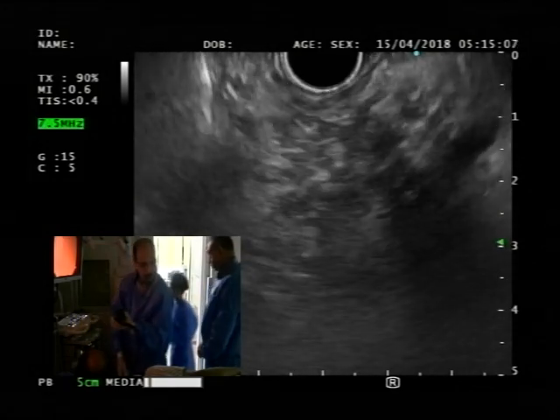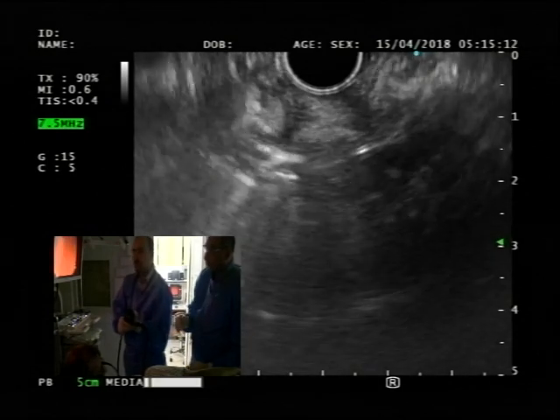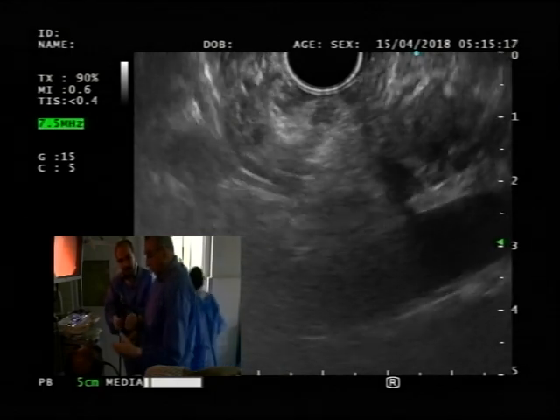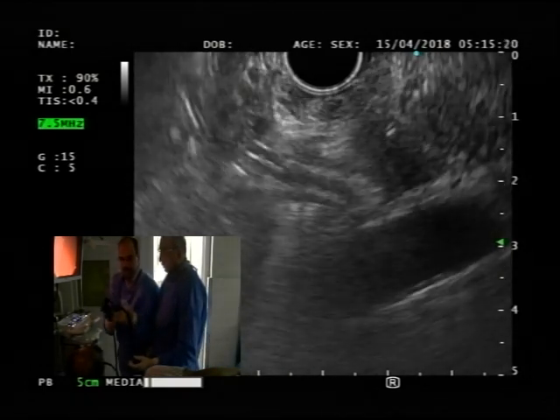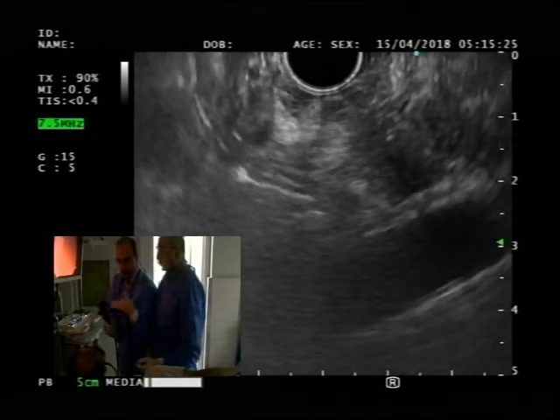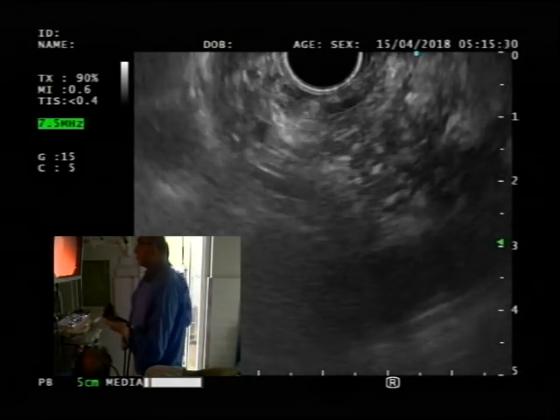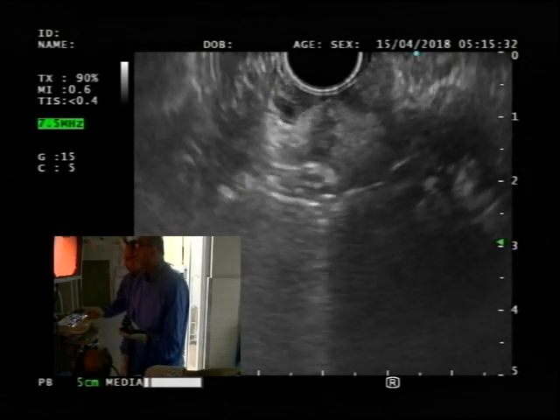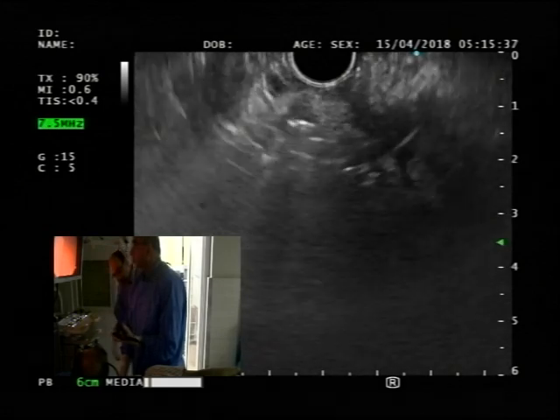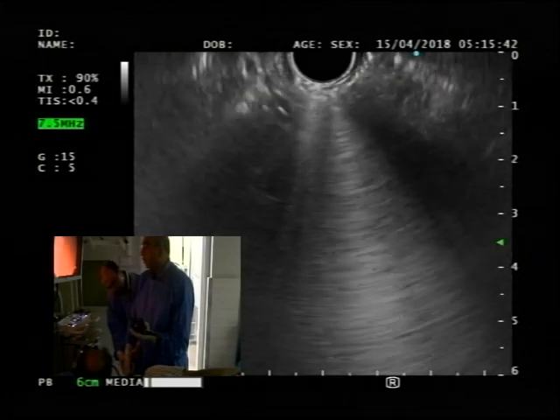So what I would like you to do right now is, since we're already positioned and we're going to wait for them to tell us, take over. And so a couple of things. People come from this side and this side. I feel that this puts strain on you. Other people say that they can support it, but my preference is to come from this side. But everybody adapts their own sort of technique for this. So I'm going to zoom out a bit, and then you can just, again, not too far in. Hold it from where the bend occurs, right there.